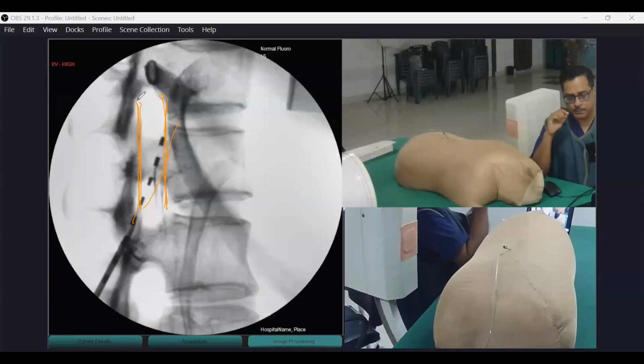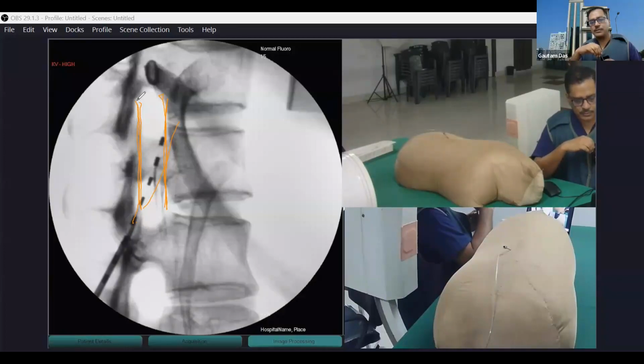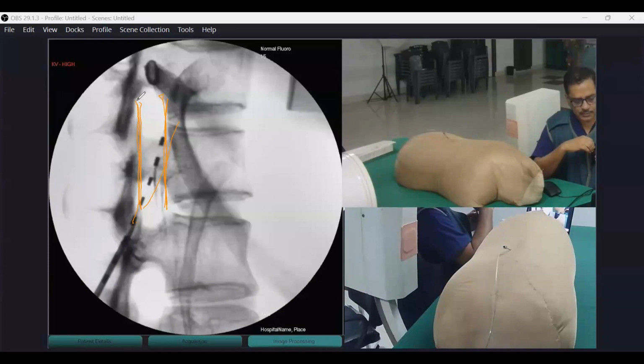Explain that anterior and posterior once again. Sorry to disturb you. The same thing, just two sentences back. You draw the lines, sir. Anterior and posterior, from there you just explain to me, sir.